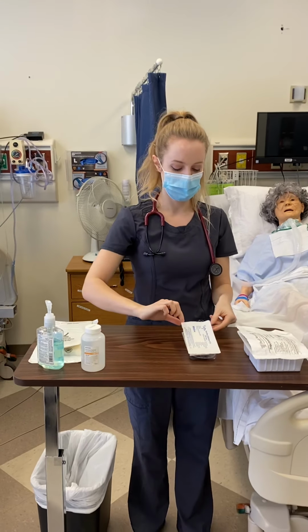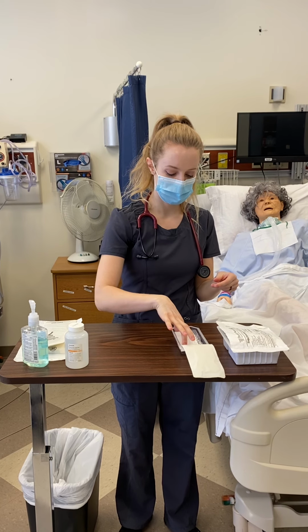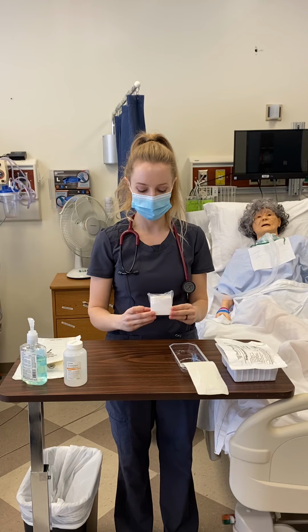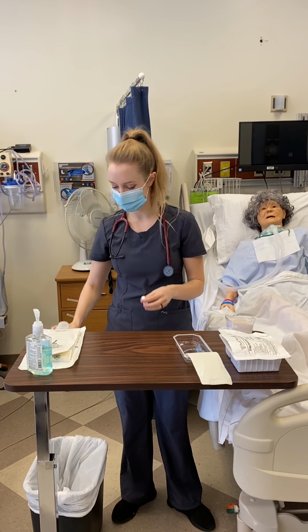So once I have my patient all ready to go, I will again perform hand hygiene, and I will open my suction catheter kit, and I will very carefully remove the container for my lubricant and pour saline in, and I can lift this over the trash can first.